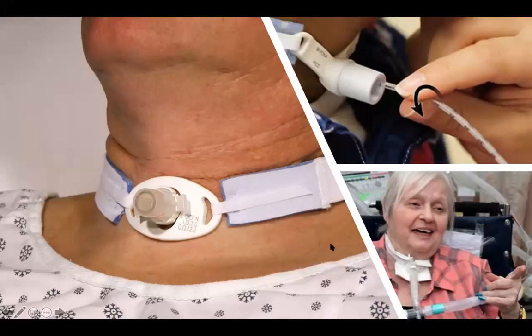Okay. All right. So the first question, yes, we will get to the differences between cuffed and uncuffed. The first question was, will the patient be able to phonate after the surgery? And I'm assuming they mean after the surgical insertion of the trach. Initially, no, because after the surgical insertion there will be a lot of swelling, a lot of bleeding, and their whole airway will be blocked, and a trach will be inside.